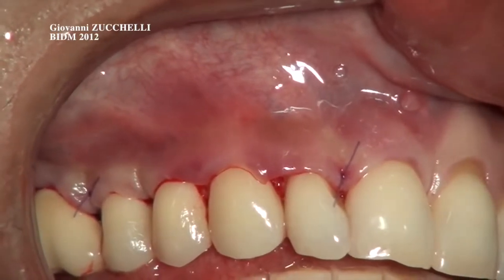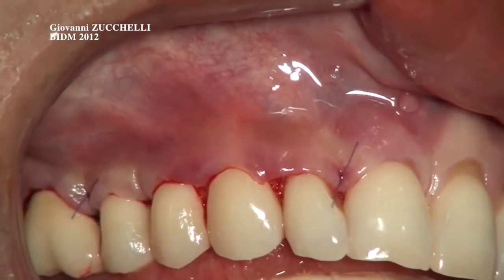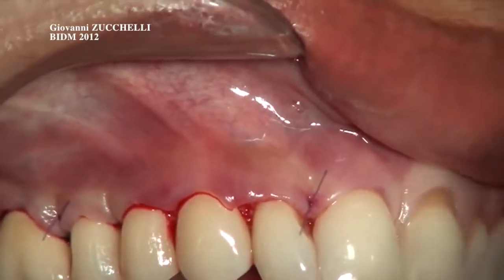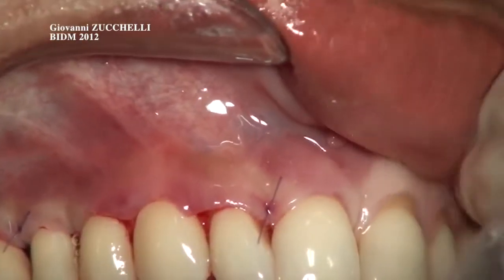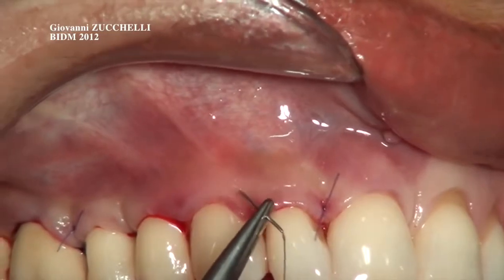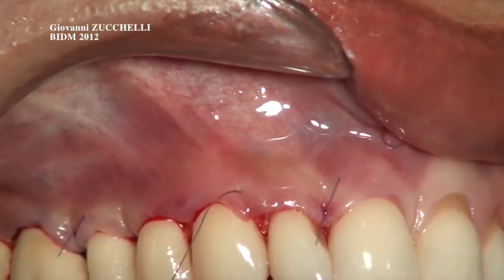So thanks to this multiple flap, every single surgical papilla helps the other one to be placed in the right position with no tension. So now we are going to make the last suturing. So three sutures to cover six gingival recessions. Again, surgical papilla, perforation of the anatomic papilla at the level of the canine.